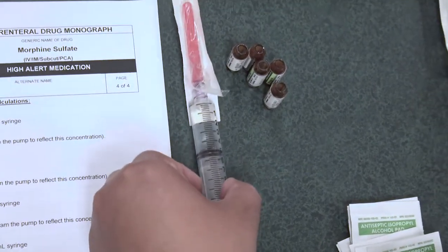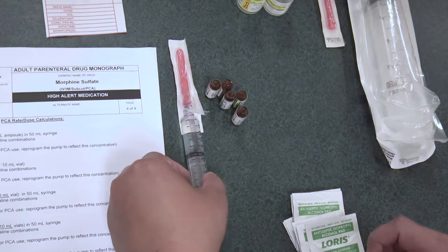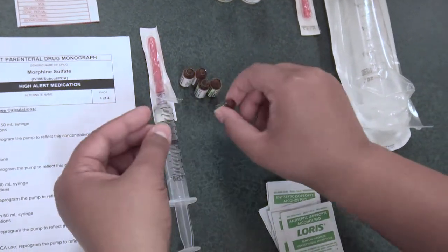So I've finished drawing up my 5 milliliters, which equals 50 milligrams, again because of the 10 milligrams per milliliter.